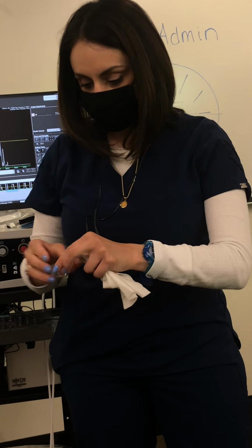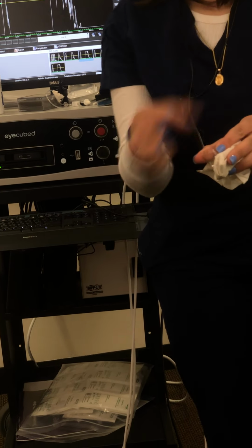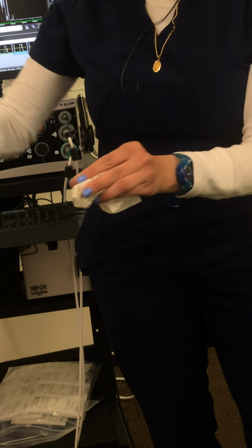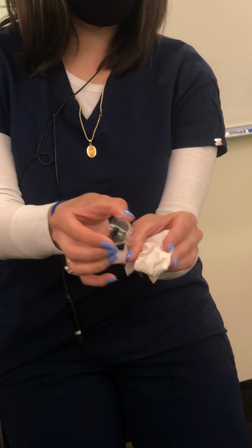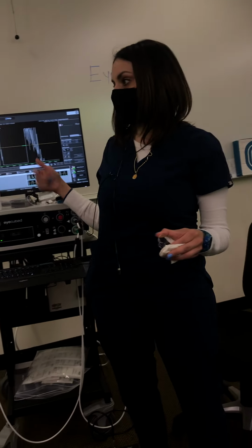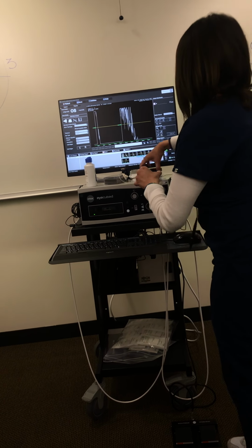So usually what I'll do is keep the tissue on the side of the patient's eye. That way, if it spills out, it doesn't drip down into the ear. It will go directly into the tissue, and I'll just do my scan. Then when I'm done, I just lift the cup up a little and let all that water drain into the tissues that I have. So you're still using both hands with either one. So there's no lid on the cup or anything like the one that we have? No.